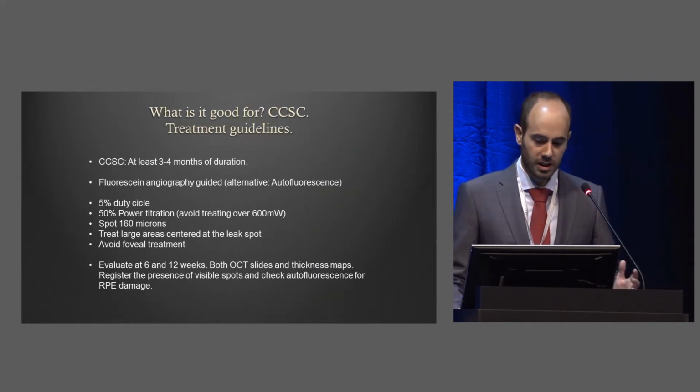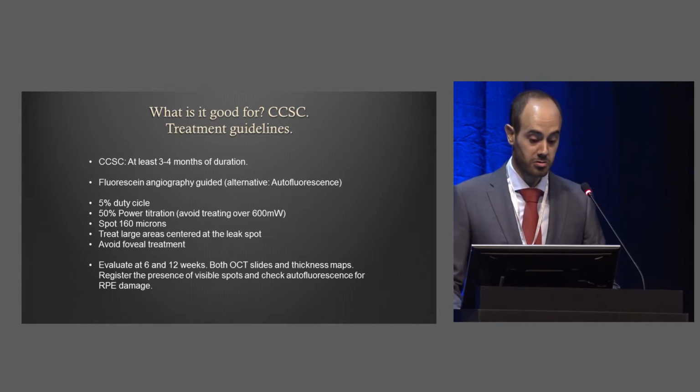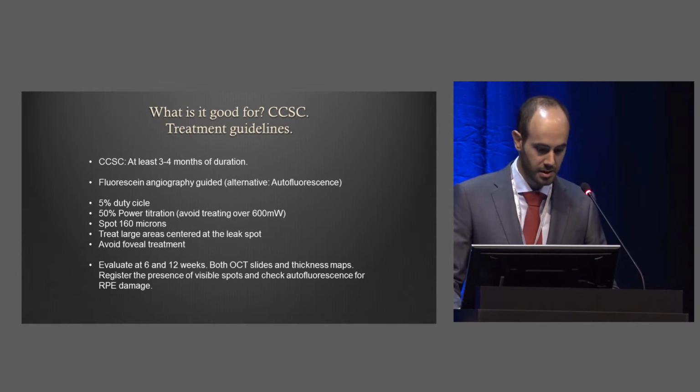I will not get into the specifications of data, just use angiography as a guide. Although I have found autofluorescence to be quite reliable too, at least in not too chronic cases with not too bizarre autofluorescence imaging. 5% of the cycle is enough.